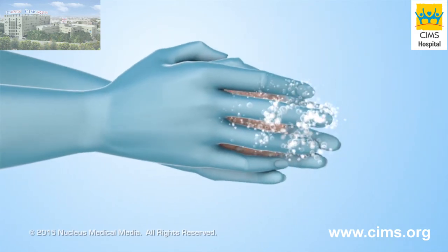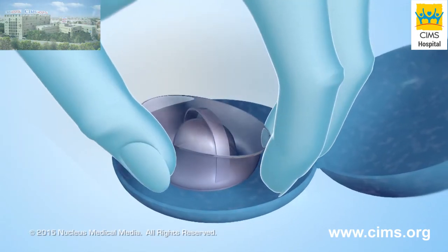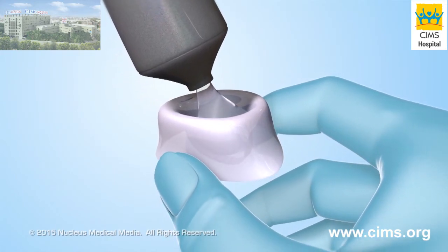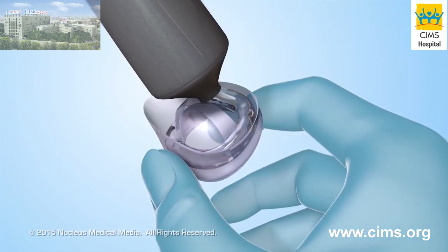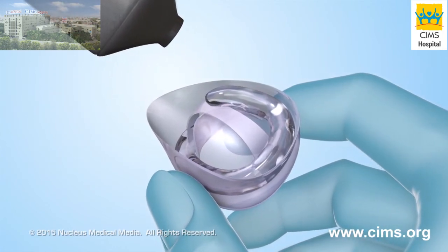To use a cervical cap, wash your hands and remove it from its container. Apply 1 quarter teaspoon of spermicide inside the dome, up to and including the brim. Apply an additional 1 half teaspoon of spermicide in the groove between the outside of the dome and the brim.